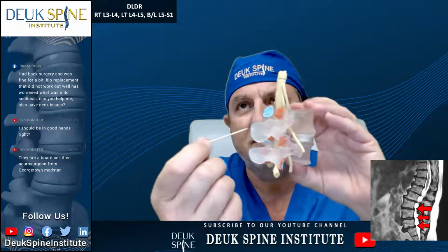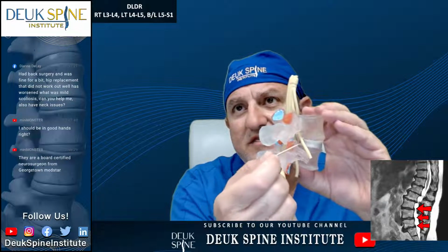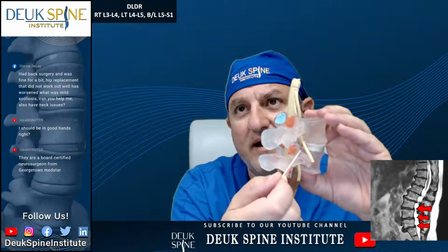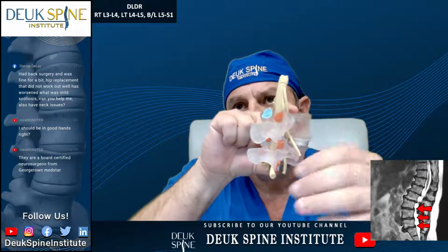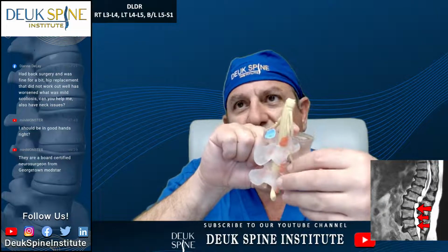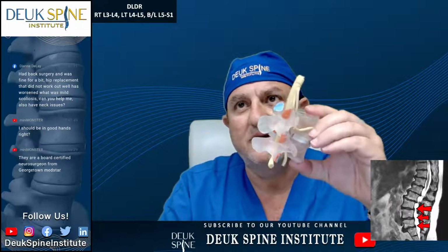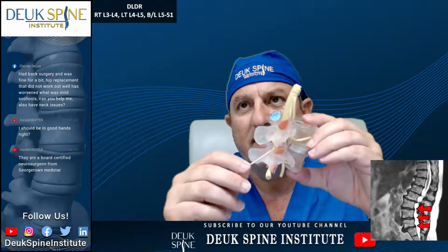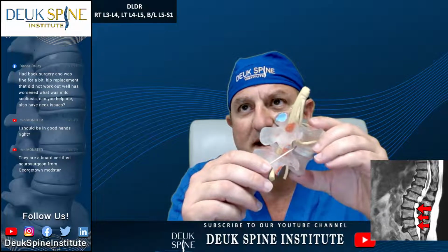I want to show you this tear right here. I think you can all see it right there. Just there. That little red line is the tear. And if we move the nerve root over a little bit, you might be able to see it a little bit better. So let's see here if I can do that. Move the nerve root over. And there's the tear right there. It's that little red, you guys see that right there? The tip at the back of the disc.